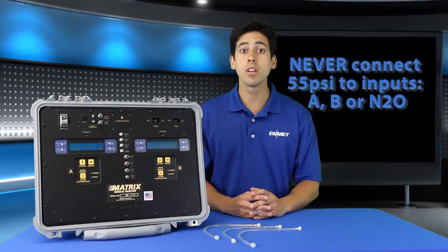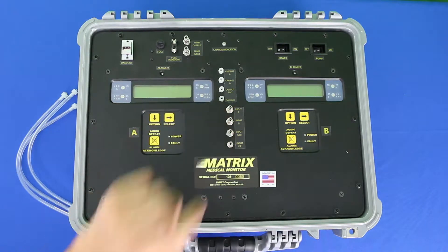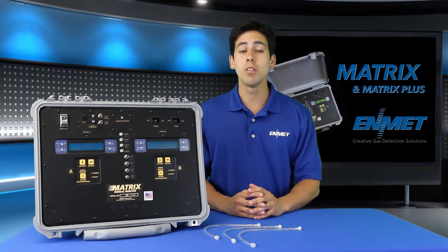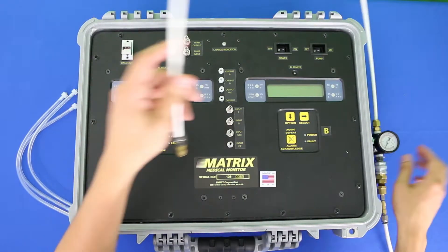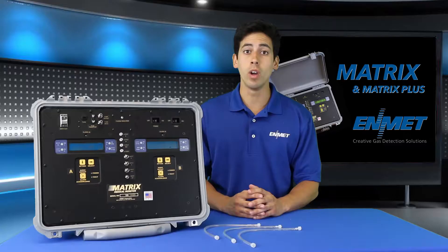Please note: never connect 55 psi directly to inputs A, B, or N2O or damage will occur to your matrix unit. Now you'll need to connect your pressure regulator outlet quick disconnect to input DP, which is the dew point inlet.